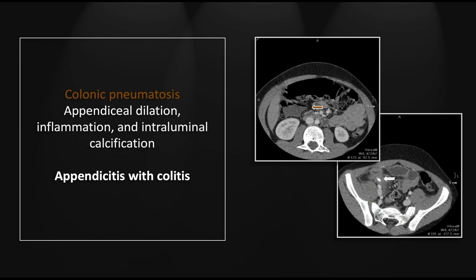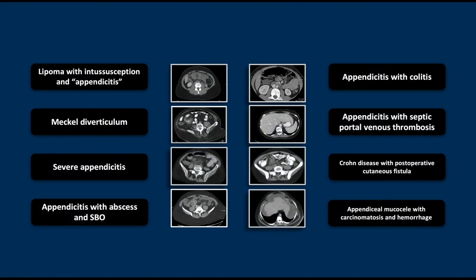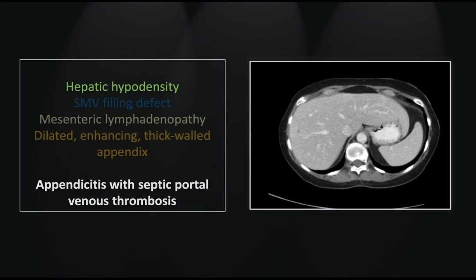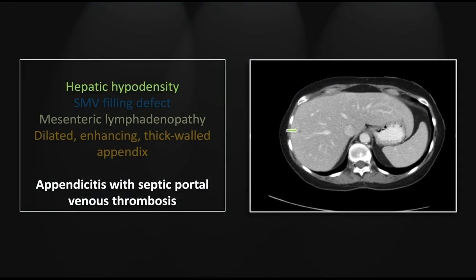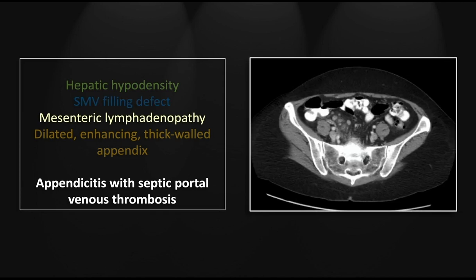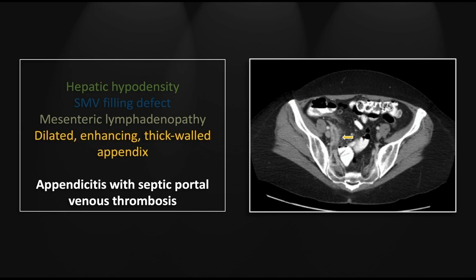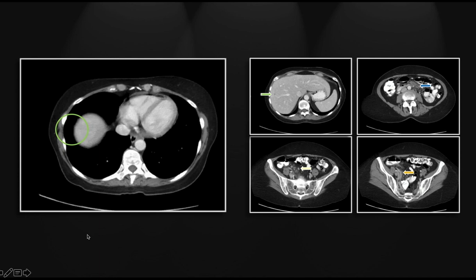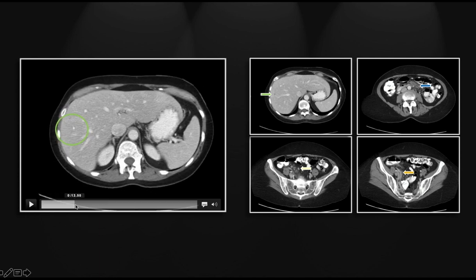Our next case is appendicitis with septic portal venous thrombosis. In the liver, there is a small hypodensity with a surrounding hypervascular, hyperdense triangle of increased enhancement related to portal venous obstruction — as we saw in the hepatic vascular lecture. In the superior mesenteric vein, you can see a filling defect. In the right lower quadrant, there is significant adenopathy, and in the pelvis, a thick-walled dilated appendix dropping into the right true pelvis.